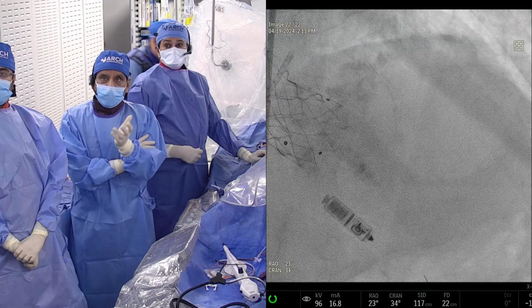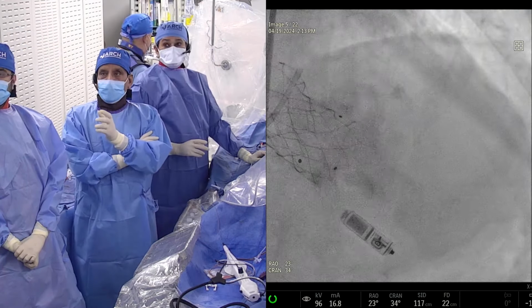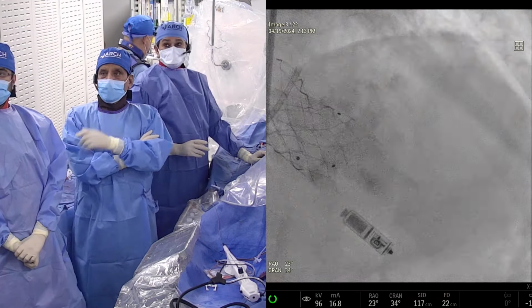Something is there or nothing. I mean, clearly something is there. The question is what it is. And that's, as you can see, the discussion point. We have taken, Anu has directly wired the rotor wire and we'll be doing this IVUS on the rotor wire.